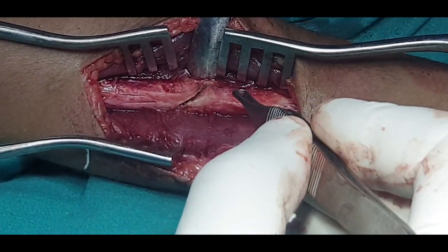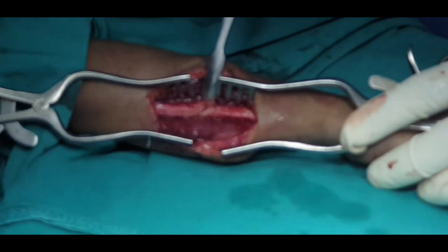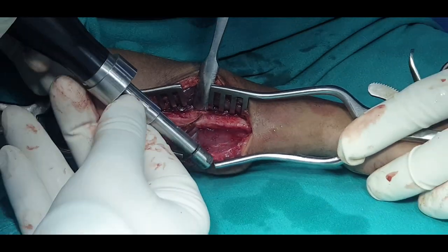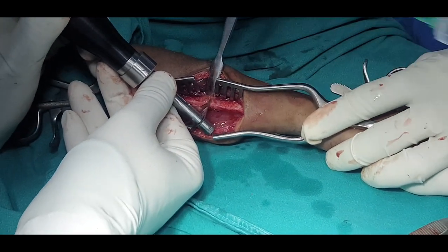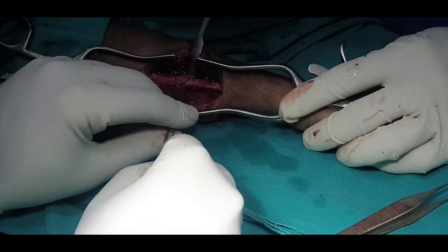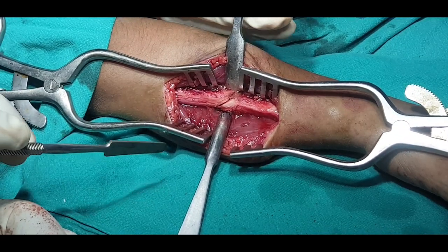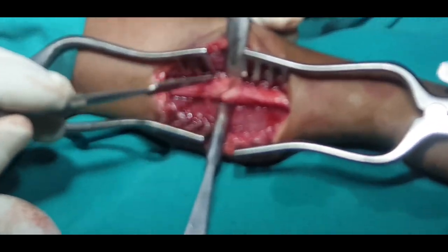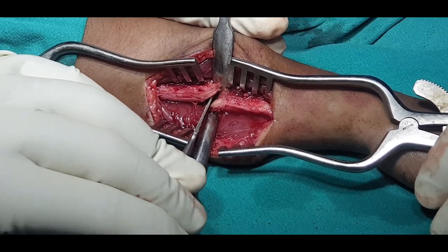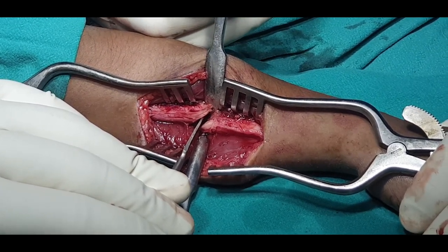I have just made part of the osteotomy. When making an osteotomy, do make sure you have a Hohmann retractor on the other side because the interosseous membrane and vital structures are not far from the bone. This bone is very narrow — like a metacarpal of an adult, in fact narrower. Be extremely cautious while doing an osteotomy. I am using the saw and protecting it with my Hohmann. For the last bit, I will use a McDonald's elevator to just break it. My advice is to preserve the periosteum. Do a controlled break. Now this osteotomy is complete — you can see it is opening up. Next step will be to gain the length and put a plate on top, and let us see whether it reduces the radial head.